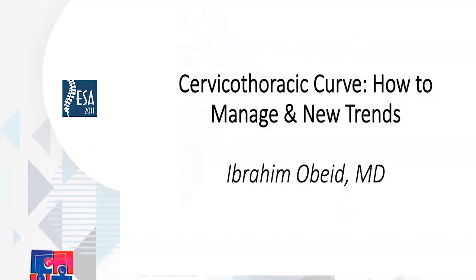New technologies played an important role in their treatment and pushed far away our surgical possibilities. For many reasons, such as the pedicle size, the vertebral orientation, and the complexity of the anatomy, navigation is, in my opinion, one of the most interesting tools that we have added to our technology in the last decade. It allows, at the same time, better positioning of the implants, but more important is that it permits to control the vertebral resection that permit a safer and more effective correction.